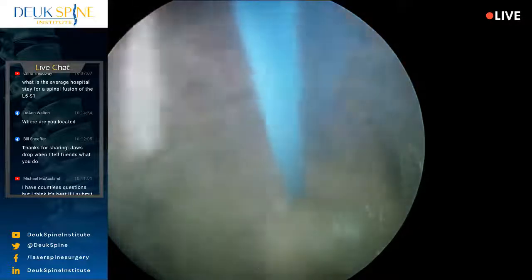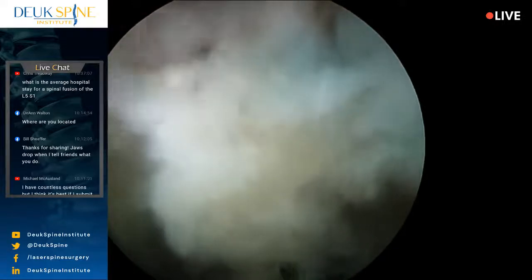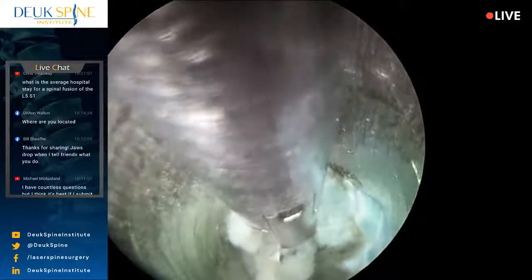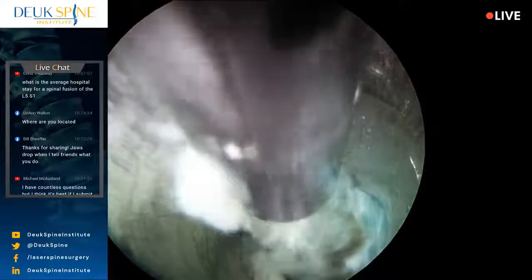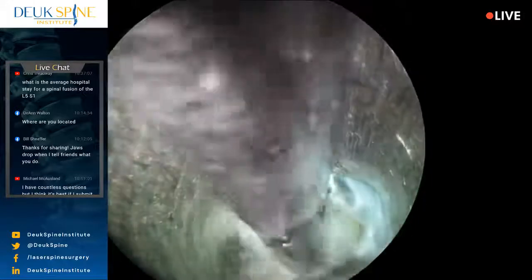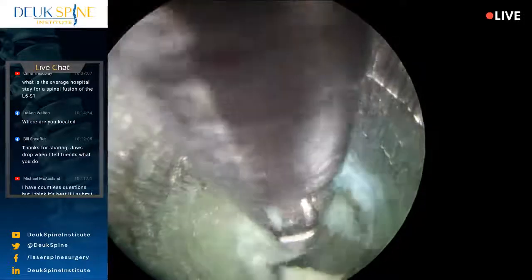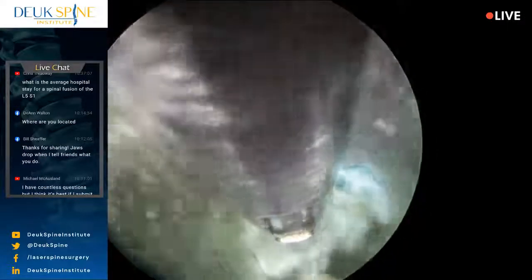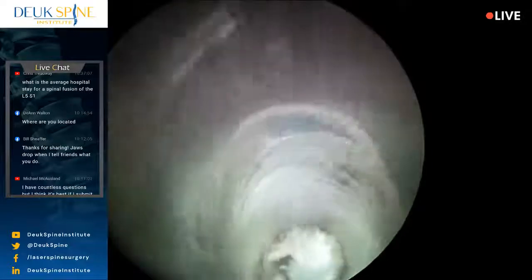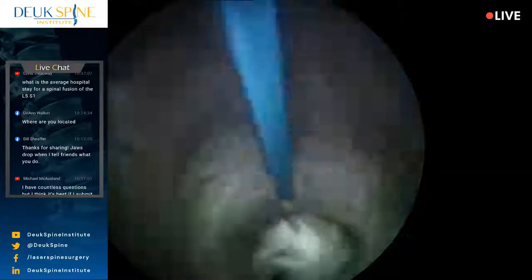Ah, another herniation. That's another big one. This is lateral. Most surgeons would not look lateral. They don't know. Dr. Young taught me, always look lateral, because that's where you'll miss something. And if you miss it, there'll still be a problem when you leave that you didn't address. I have a lot of love and respect for Dr. Young, in case you couldn't tell, okay? Because he really was an incredible person and surgeon and physician. Cared deeply for his patients and his results.